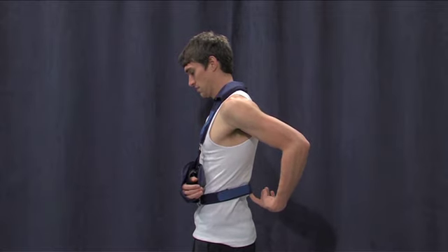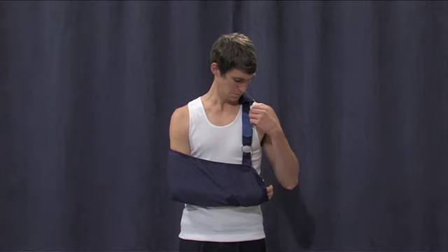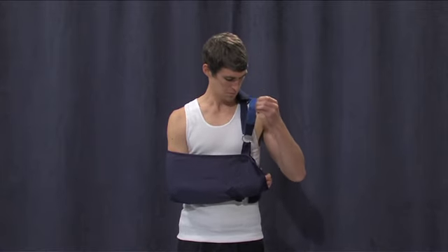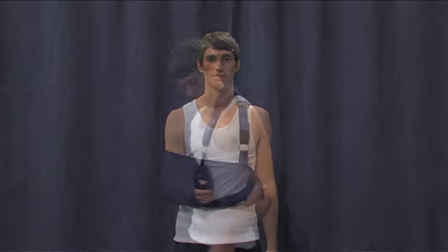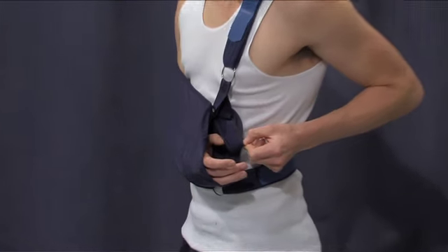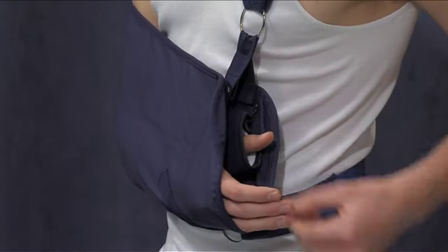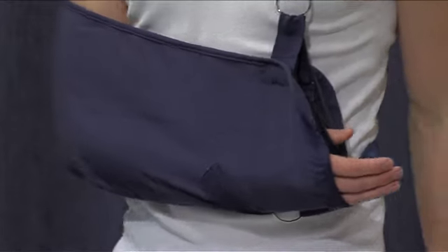The elevation of the arm can be easily adjusted by adjusting the velcro fasteners. Generally, the arm should be in a comfortable position and the waist strap not too tight. This is the thumb strap, which stops the sling from sliding off your arm. If you find that the sling is not sliding off your arm, then it is not necessary to keep your thumb in the strap.